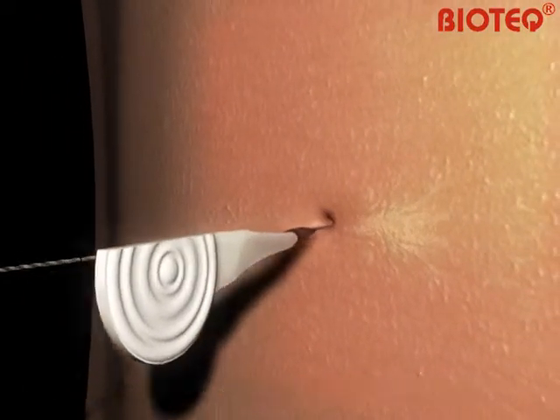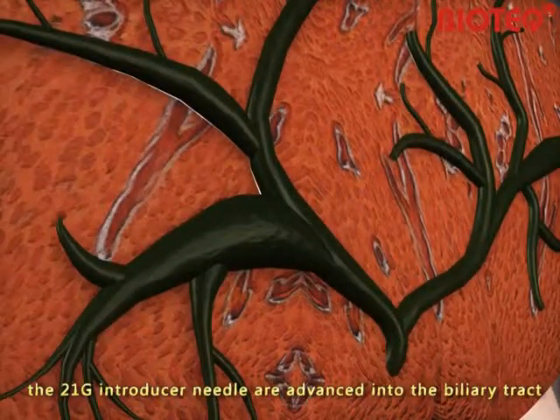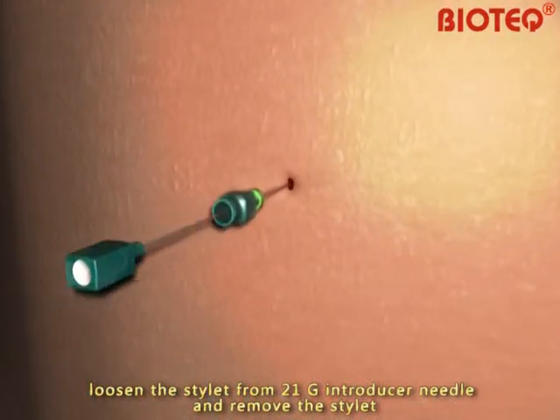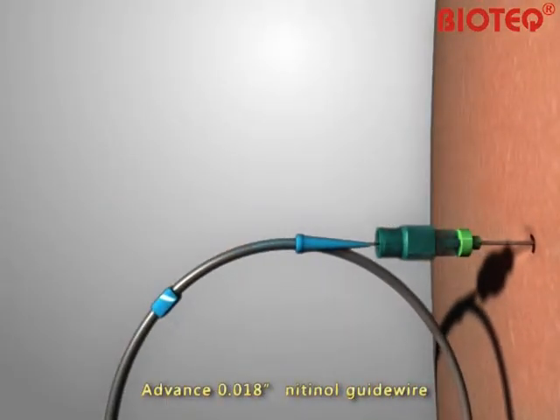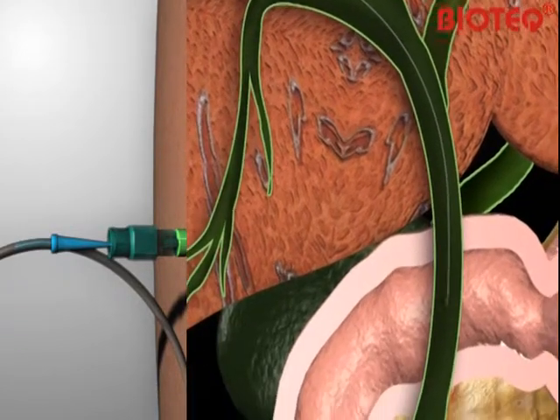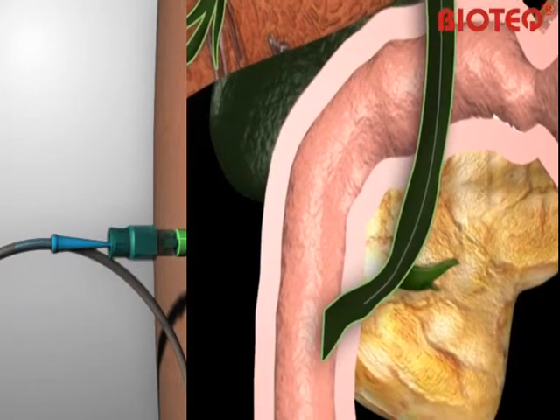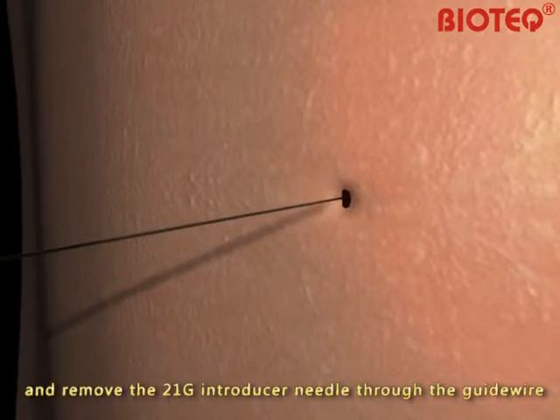Using fluoroscopy, the 21-gauge introducer needle is advanced into the biliary tract. Loosen the stylet from the 21-gauge introducer needle and remove the stylet. Advance the 0.018-inch Nitinol guide wire into the bile ducts and remove the 21-gauge introducer needle through the guide wire.